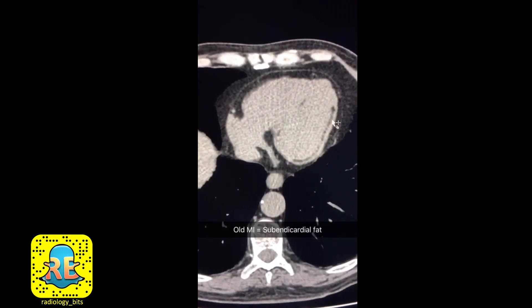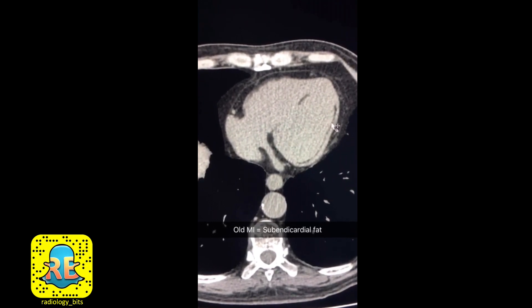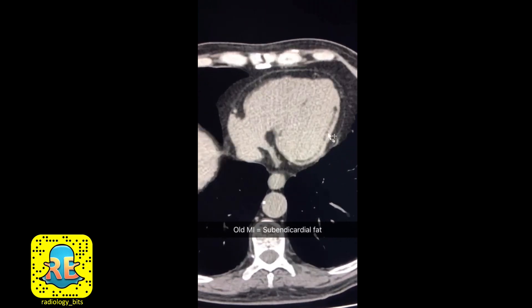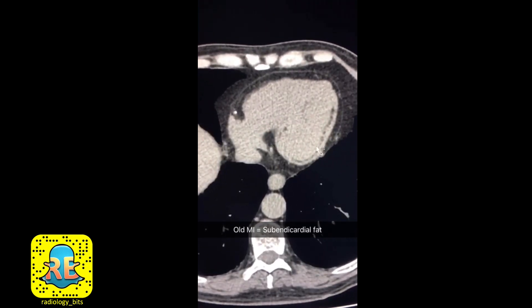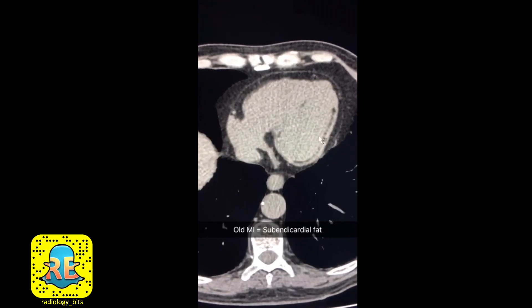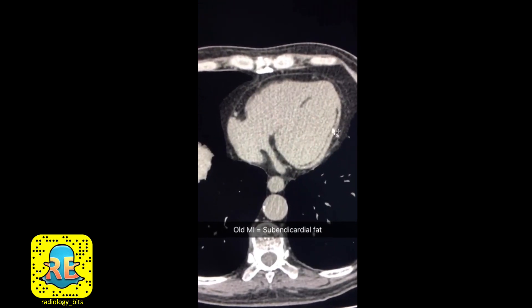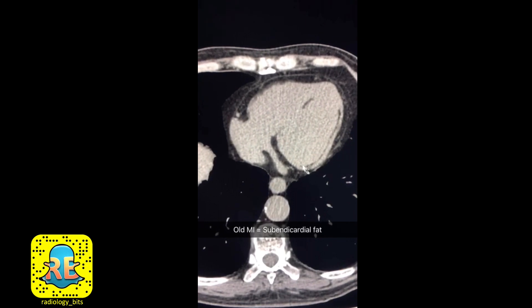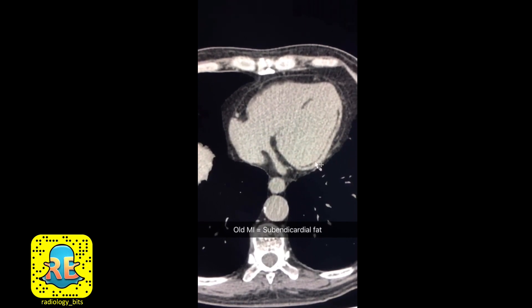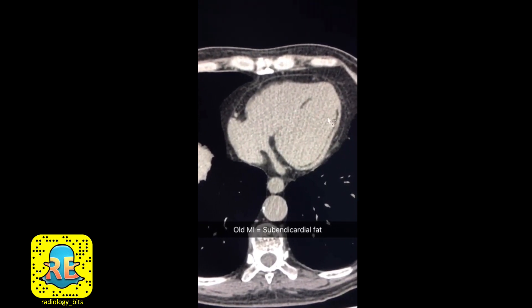These areas are sub-endocardial areas of fat deposition. There are several reasons to have fat within the myocardium, but the most common and most practical reason to remember is that of an old myocardial infarction. This location in the inner muscle is very classic — sub-endocardial fatty metaplasia is very classic for an old myocardial infarction.